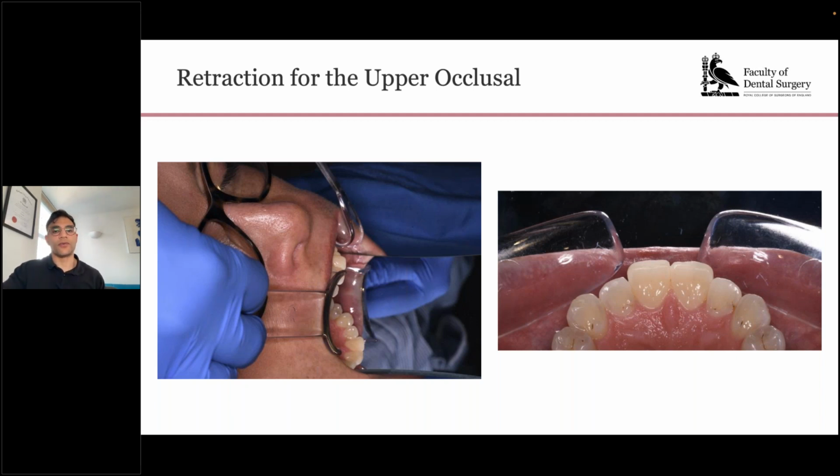So there's a couple of things that we need to take away from this slide. The first thing is that these photographs look different in their quality and the color temperature of the colors in these photographs. And that's because these were taken on a Nikon camera. The photographs that you can take on a Canon or on a Nikon tend to have a different feel about them, and it's due to the color temperature that each produces. You can either have a preference for one or the other, but I feel that Nikon photographs tend to look slightly aged, and so I prefer the ones that the Canon provides.